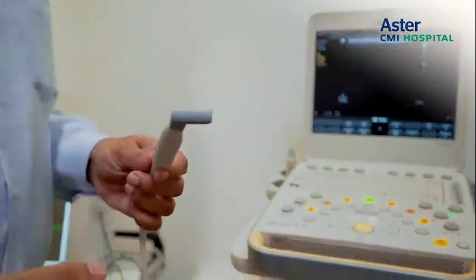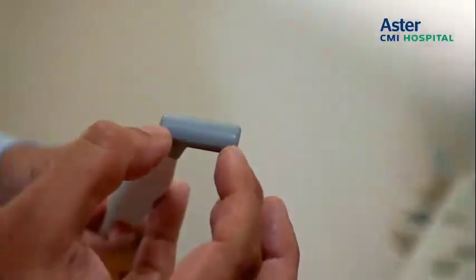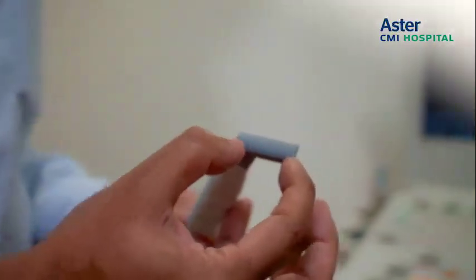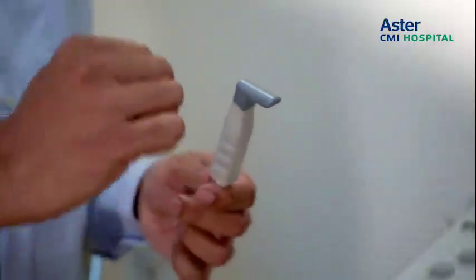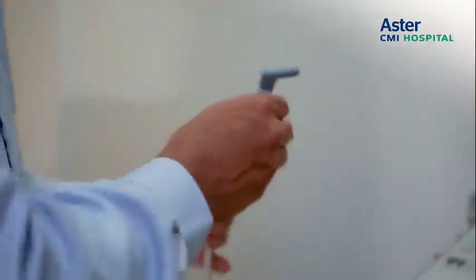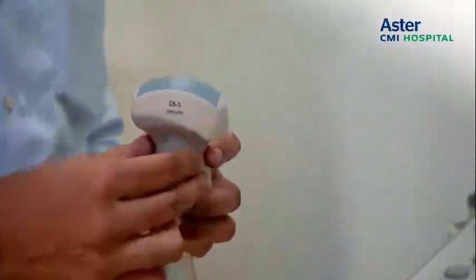The advantage of this probe is its very small footprint, so it can easily fit in the ulnar groove and those areas where we can track the nerve, which I will be demonstrating shortly. We also use a curvilinear probe for the sciatic nerve.